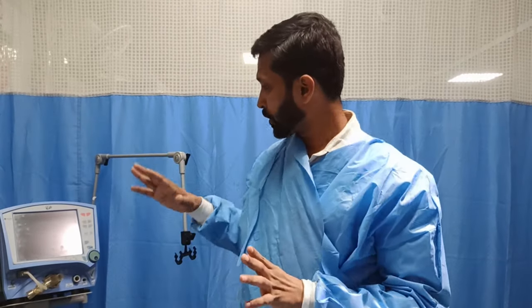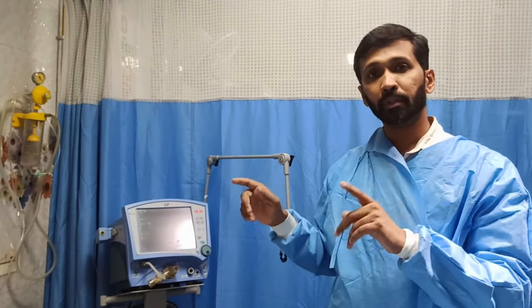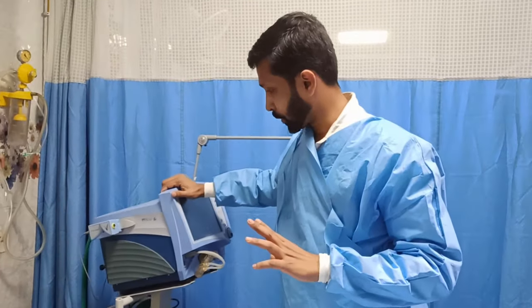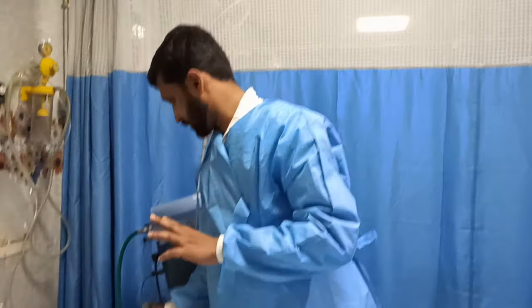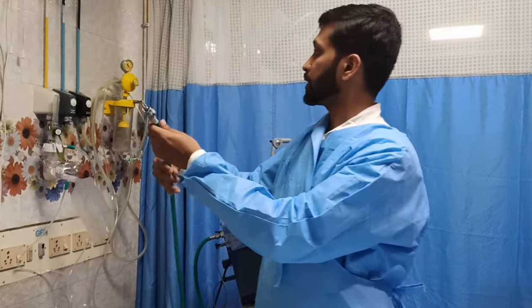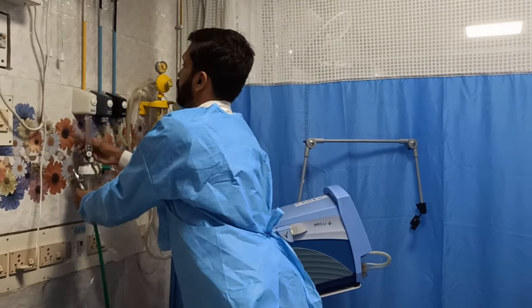After HFNO, if the patient is still not maintaining saturation with the high flow nasal oxygen, we will go to non-invasive ventilation or non-invasive CPAP ventilation. So first we will see how to connect CPAP with our Vela ventilator. Okay, here this is our ventilator. As I already told, we have an oxygen port here. This oxygen port connects with our wall oxygen.